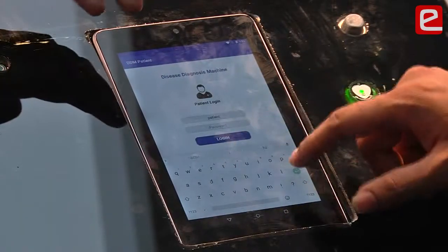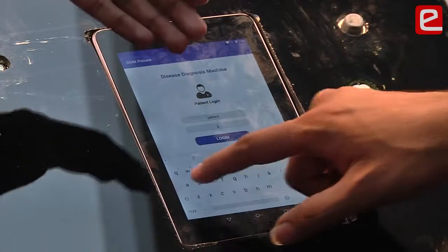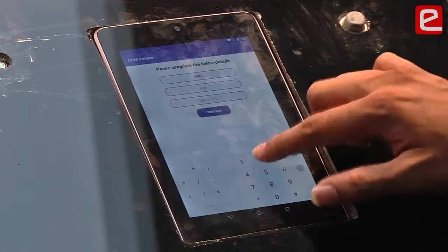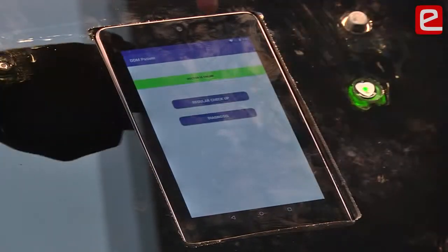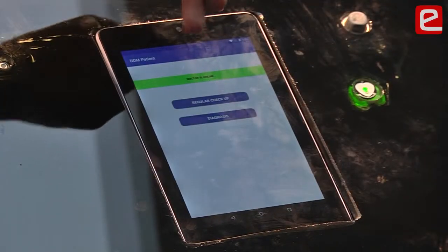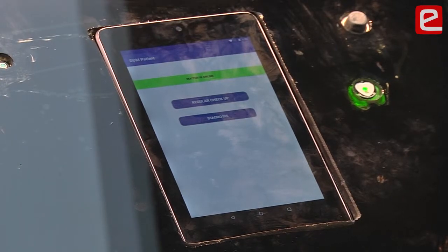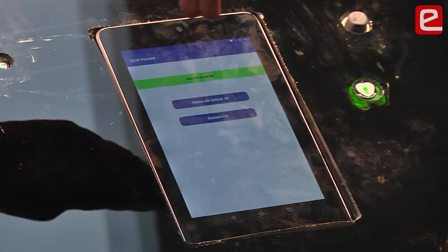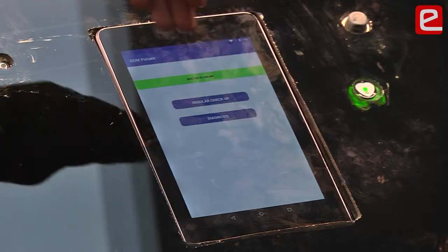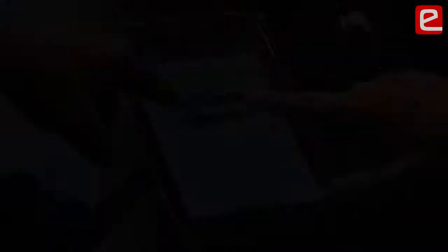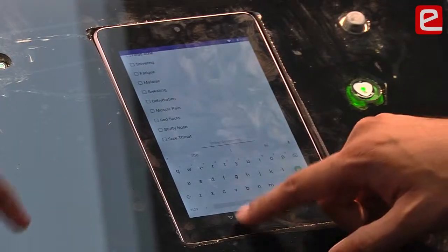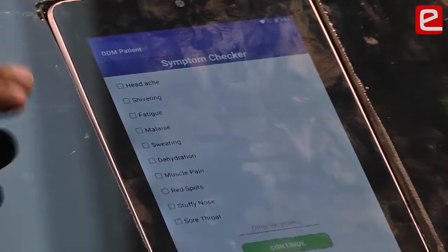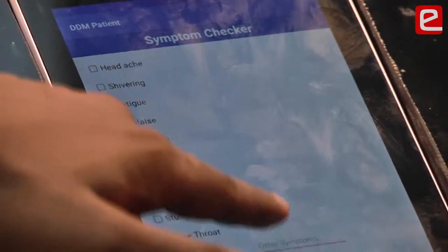This is our PatientSide app. We log in using our credentials and enter our contact number, age, and sex. Once logged in, the doctor is shown as online if he is available on his phone. We have two options: one for regular checkup and the other for diagnosis. In the diagnosis tab, we have the symptom checker.